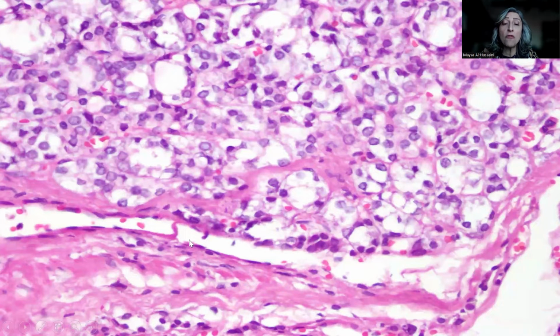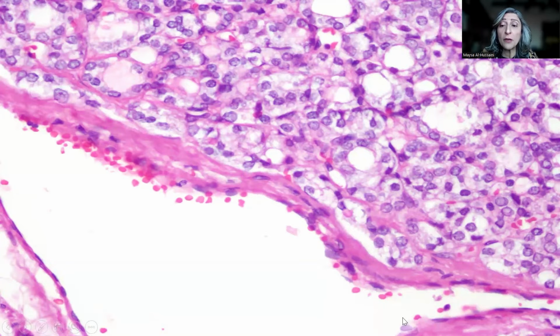And this is another focus where we have the wall of the vein, then we have the tumor thrombus attached to one side to the wall of the vein, but also importantly covered here by the endothelium. An important small tip or a trick that we should pay attention to, and this is further another focus, all within the same large vein that I just showed you. And in addition to the previously mentioned attachment to the wall, as well as some endothelial lining to the thrombus, we see here red blood cells, just confirming or supporting that this is a vein.